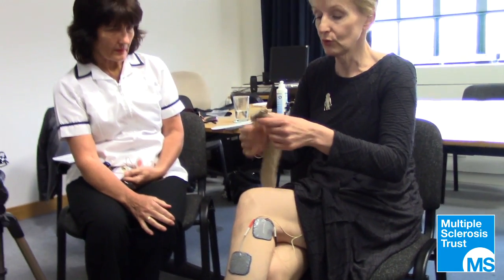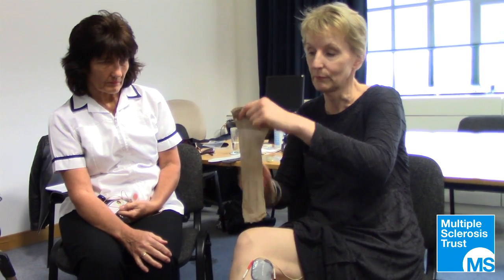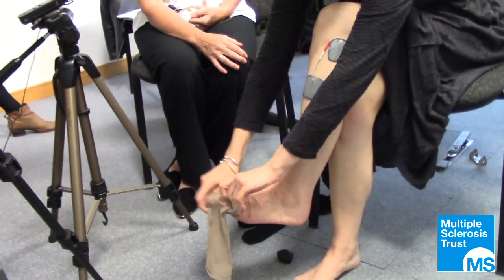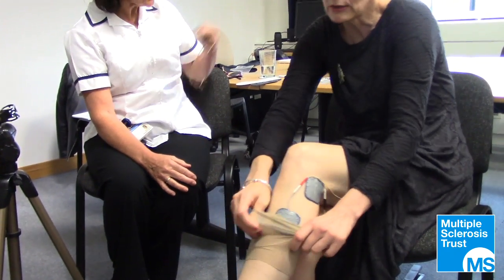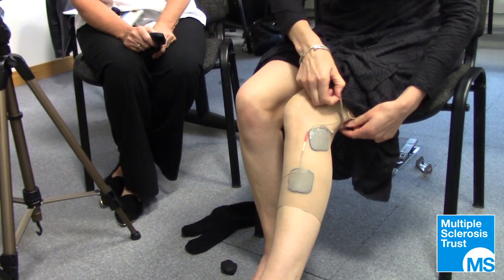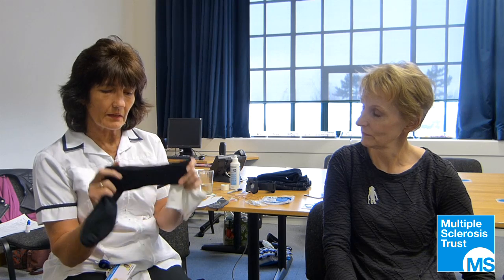You need to be able to cover up your electrodes because otherwise they peel off. What I found most useful — Christine gave me this tip and it's been an absolute life saver — you take a pop sock in your skin tone, cut off the bottom bit, make a small cut at the top so you don't cut off your blood supply, then slip it on and run it right up to where the electrodes are. Some people use tubigrip to do the same thing, or an old pair of socks — particularly for the men — cut off the foot part to cover the electrodes.